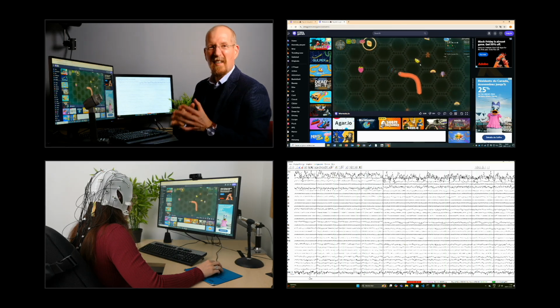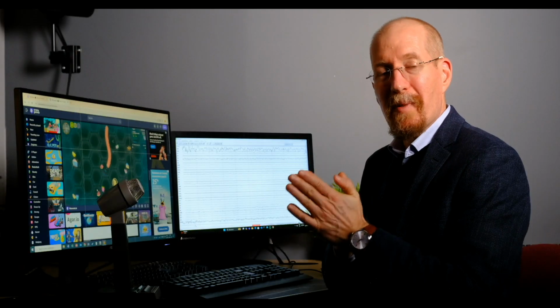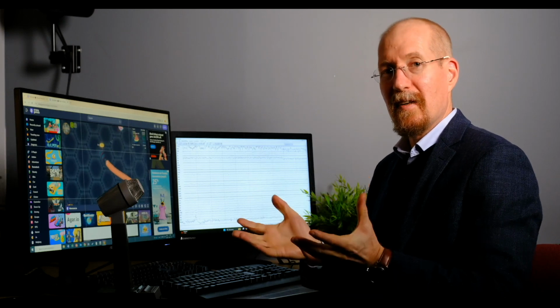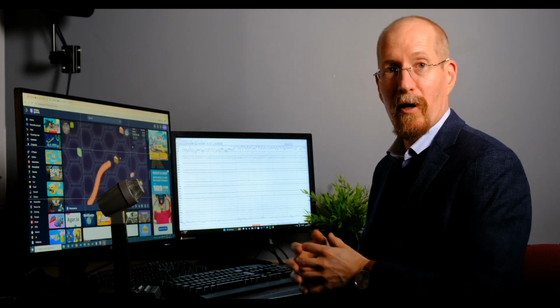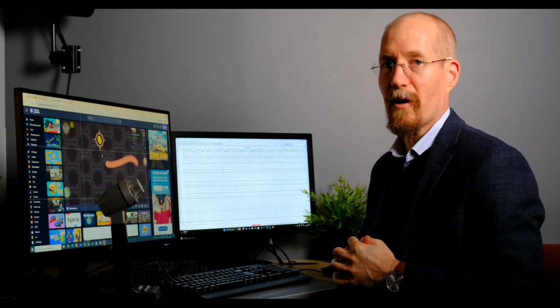The fact that it wasn't actually the start of the task is not so important. It's just to mark the beginning of an analytical time window where we will go and in post-processing look at the alpha amplitudes. So this is an example of a kind of study where we're going to look at what we call band powers or perform a band power analysis. And I mentioned alpha amplitude many times, so obviously this is going to be one of the primary targets.